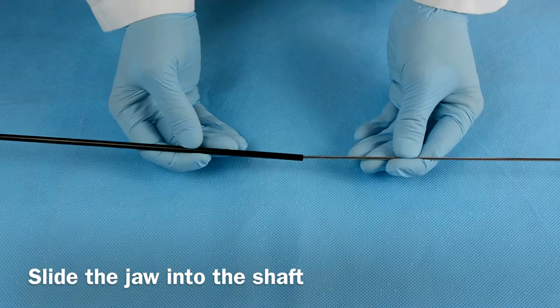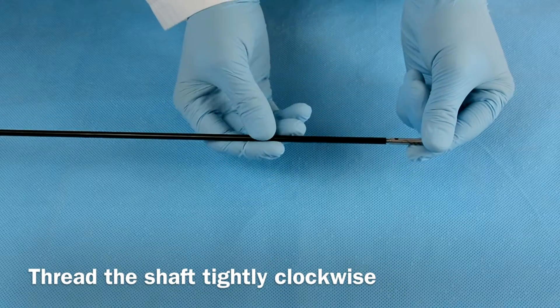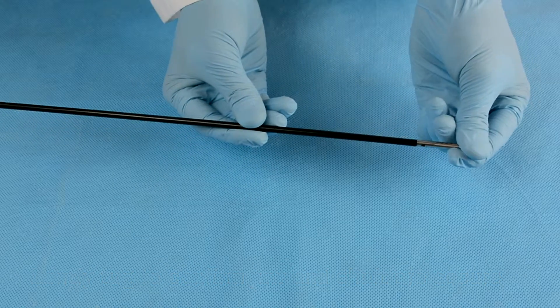To assemble, slide the jaw insert into the insulated shaft, then hold the jaw as you thread the shaft tightly clockwise. Confirm assembly by gently tugging on the jaw and the shaft. Both pieces should be secured into place.